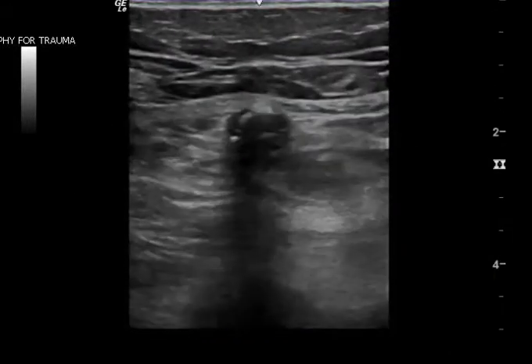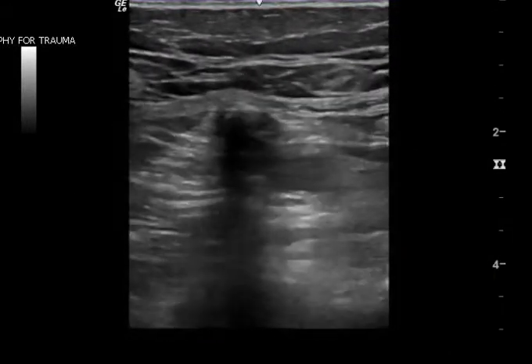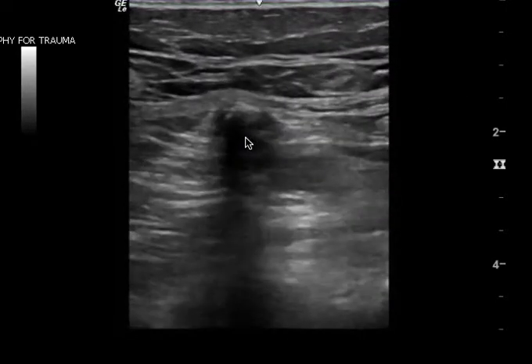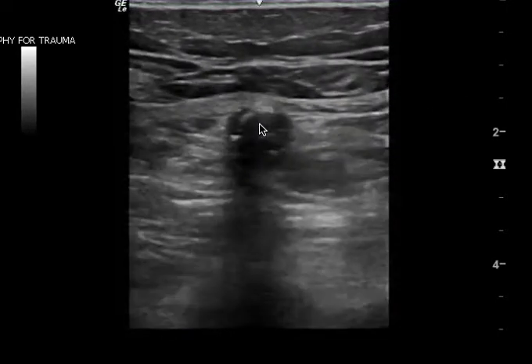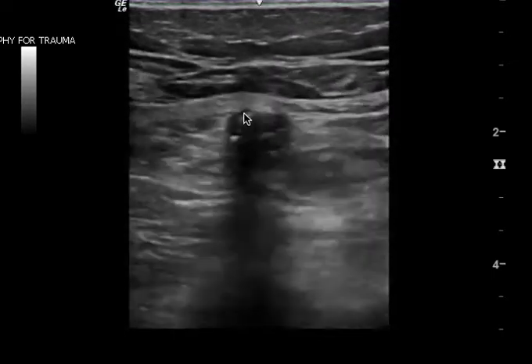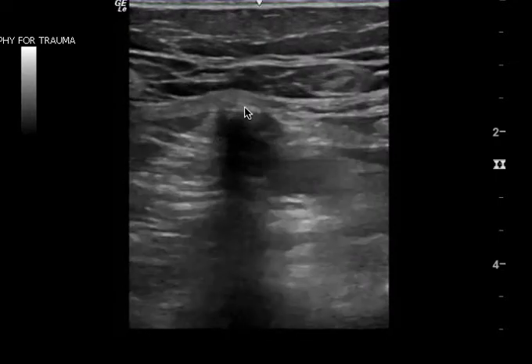The last thing just to go over is this is your DVT ultrasound, and I agree the vein collapses completely. I just want you to look at the artery here. This is sometimes what we see in older patients. This is severe calcinosis of the artery, and this happens from time to time.